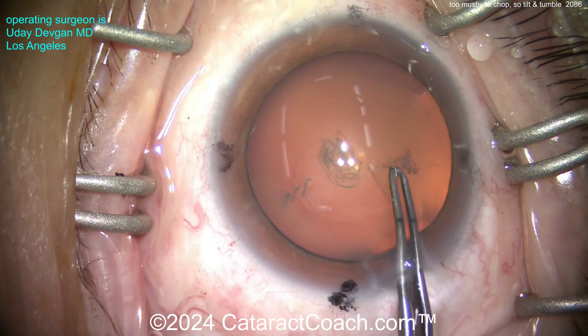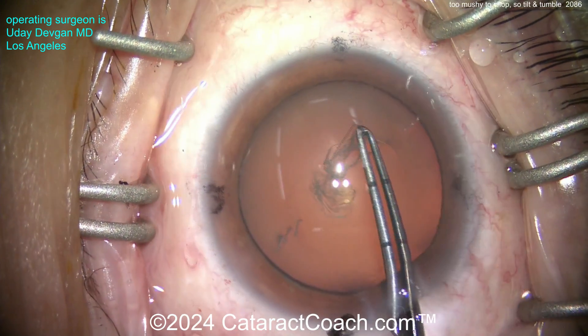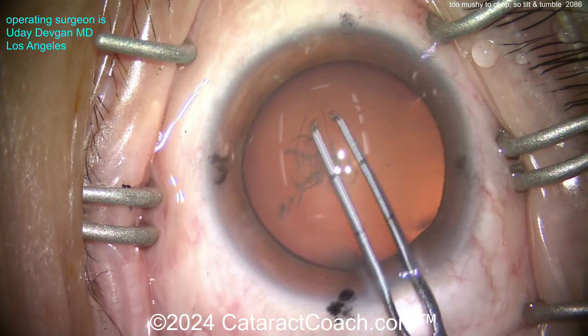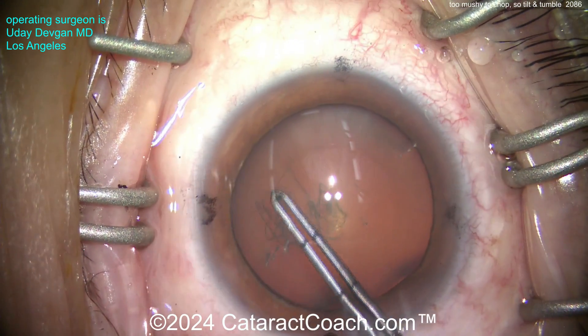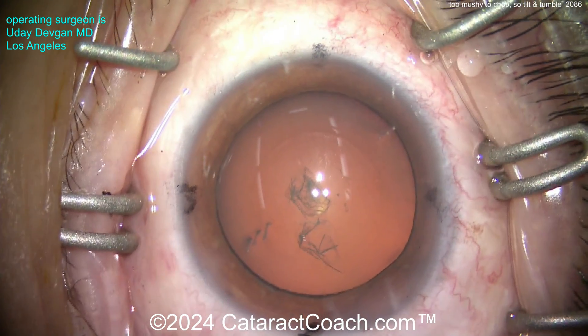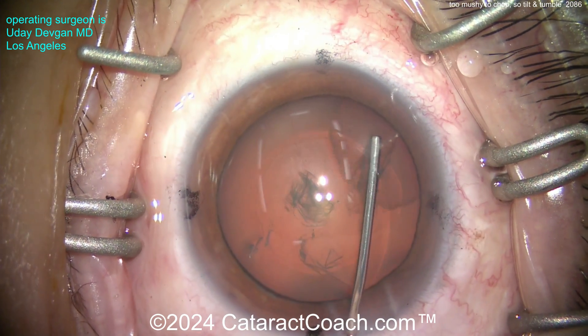Taking my time to get a nice capsulorrhexis. I'm going to show you the video in real time, unedited, uncut, just so we can see the complete cataract case. As you know, your incision and your rhexis are your signature - we'll see them when we look in those eyes years and decades later. Beautiful five millimeter rhexis, measured out.